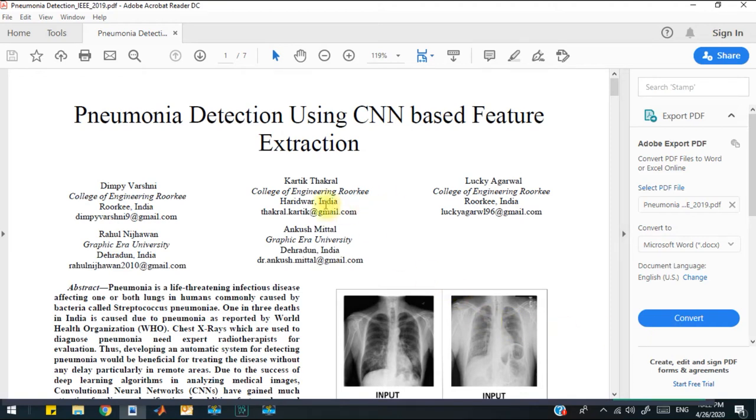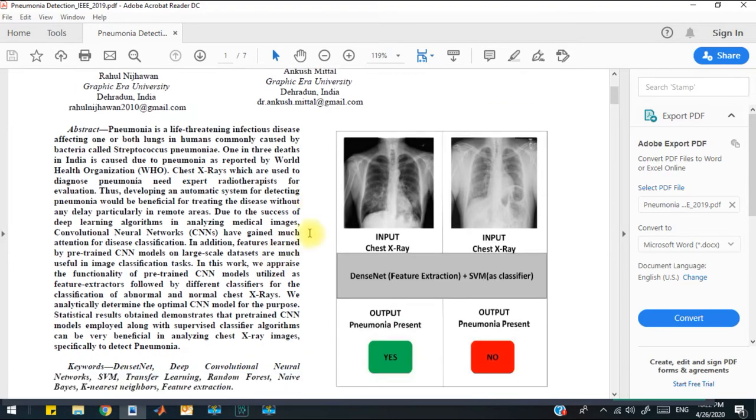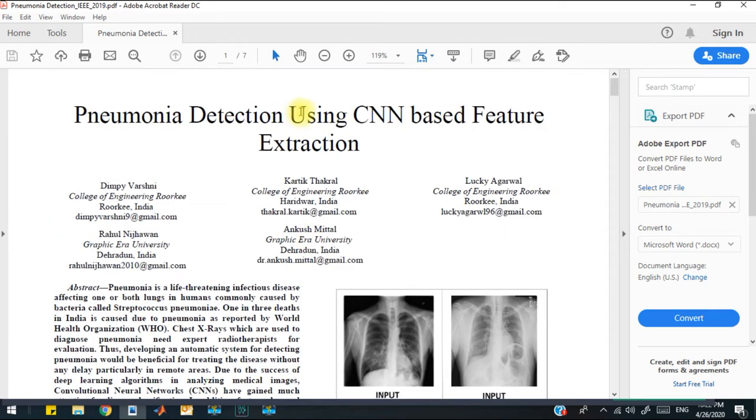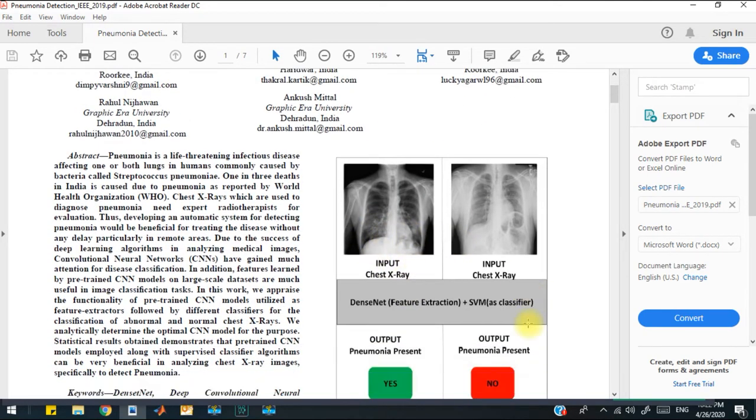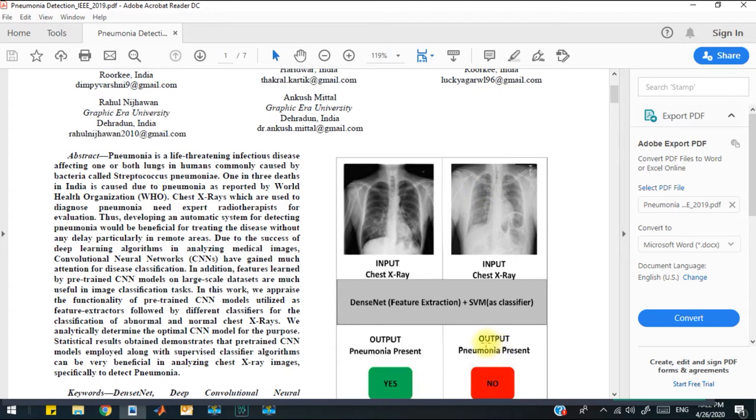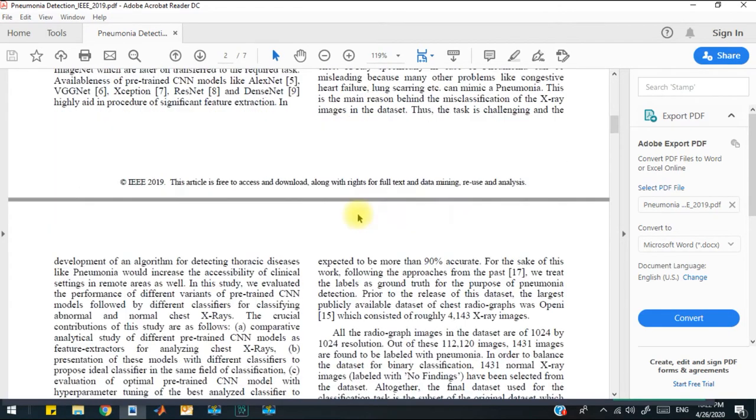Hello, my name is Fawad, and this video tutorial is about developing code for pneumonia detection using deep neural network models. Here we have a paper for pneumonia detection using convolutional neural network for the feature extraction process. There are two different types of images: one from the pneumonia patient and the other x-rays from the normal patient. We have to detect whether an x-ray contains pneumonia or not.